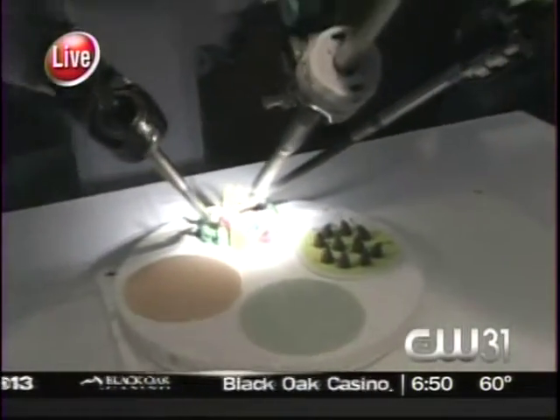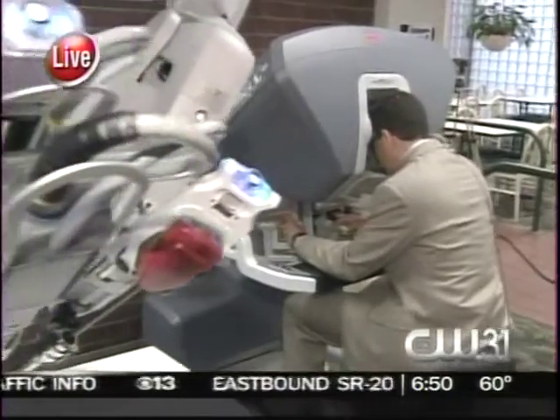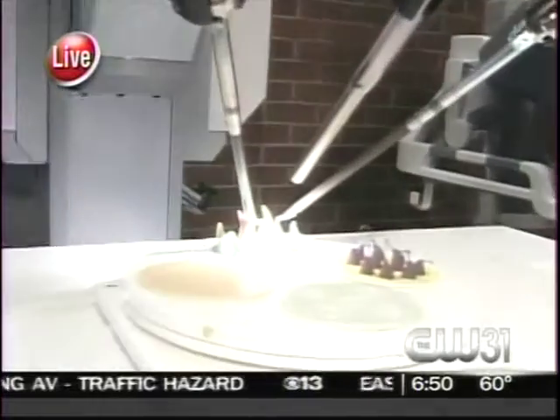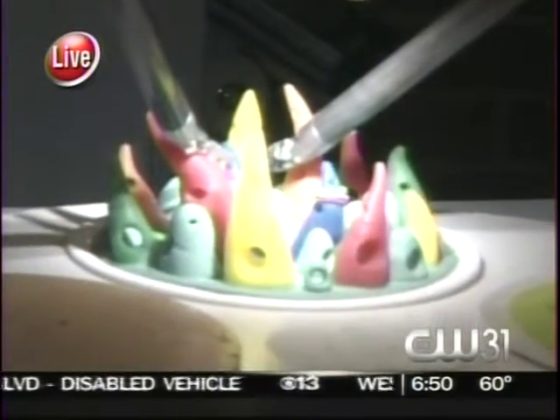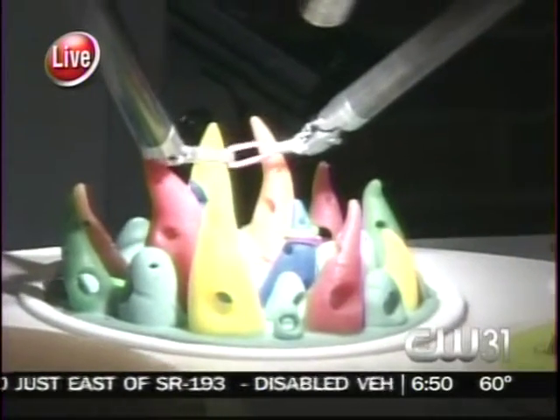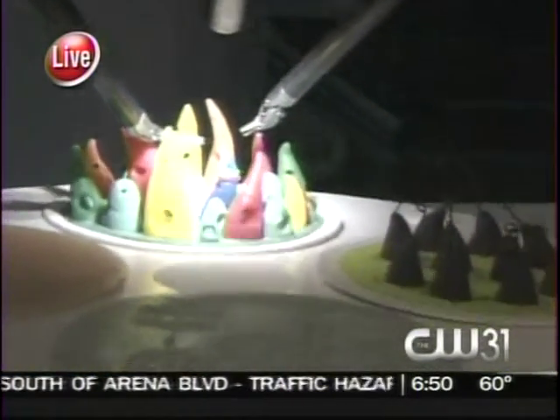You can move your camera around and get in very, very close to the tissues, whether it be a tumor or blood vessels or anything like that. And I understand it actually affects recovery time. Recovery time with this type of surgery, because the incisions are so small, is cut in less than half. So you have patients going home the same day in some cases and back to normal activities in one week or two weeks, which is unheard of when you talk about procedures such as hysterectomies or removal of fibroids.